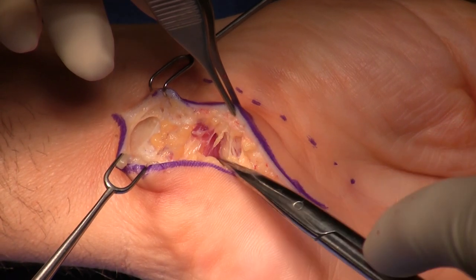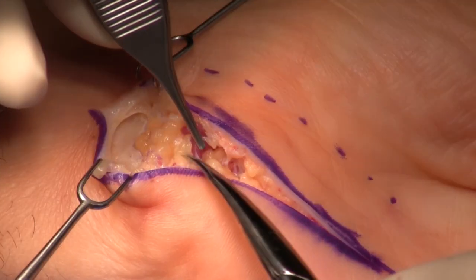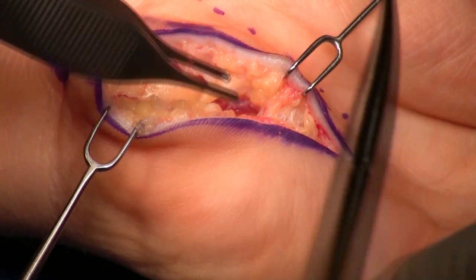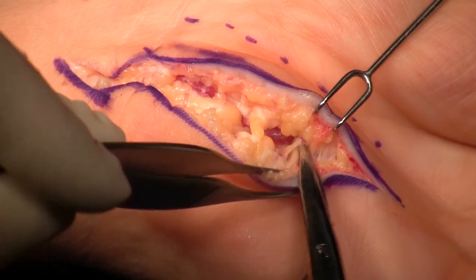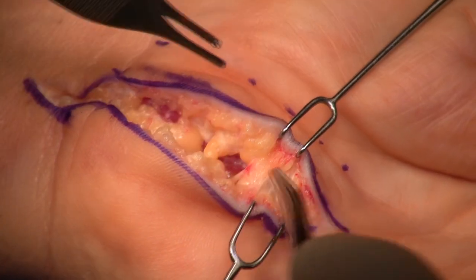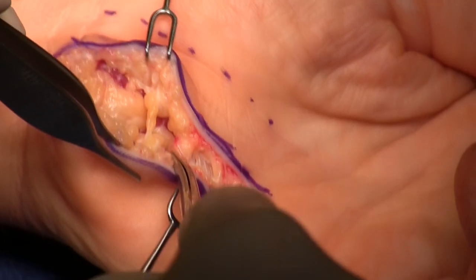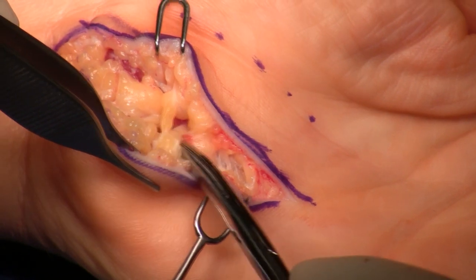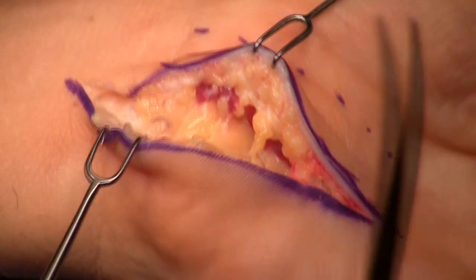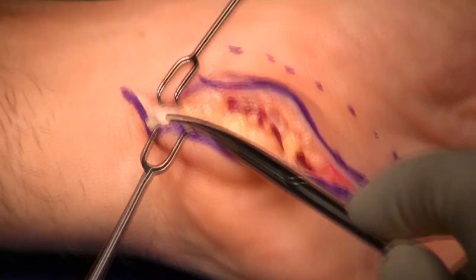The first step in a Guyon's release is to open up Guyon's Canal. The palmaris brevis has been divided. In at least 15% of people, at the distal end, we'll see a cutaneous branch that comes up to the skin of the palm. It's quite large — I'm pulling on that branch and you can see the skin moving. I want to protect that branch, and it certainly is large enough to be easily protected.